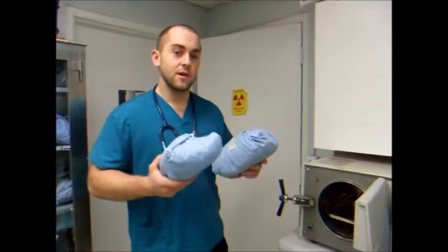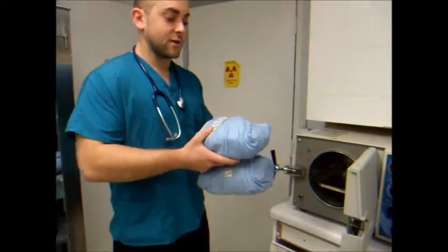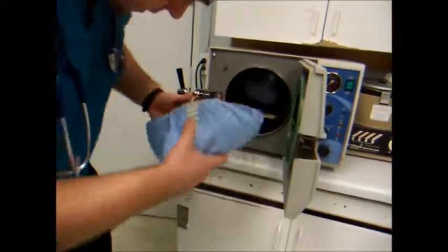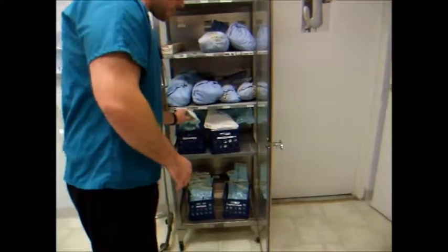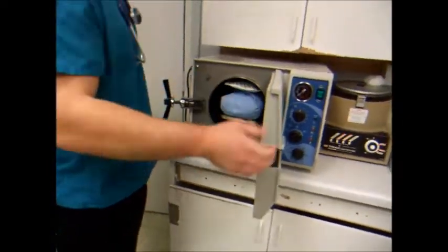I'm going to demonstrate how to properly pack the autoclave. You want to make sure that they're not stacked on top of each other. So you've got one in there on top there. We'll go right in behind it, and you can throw in smaller packs on top, but you don't want to stack up like 2 spade packs on top of each other.